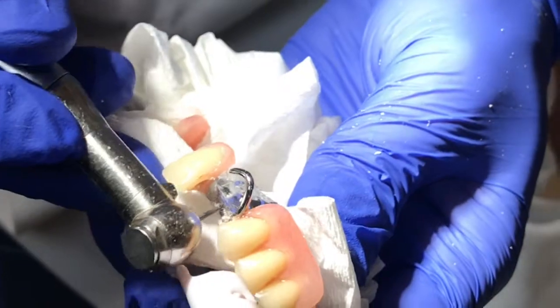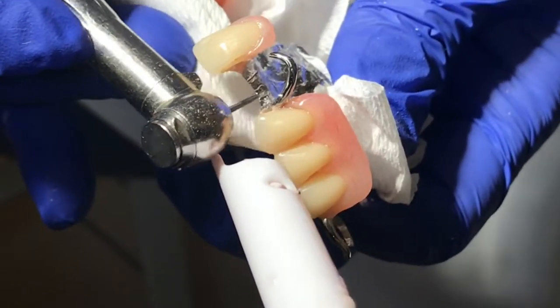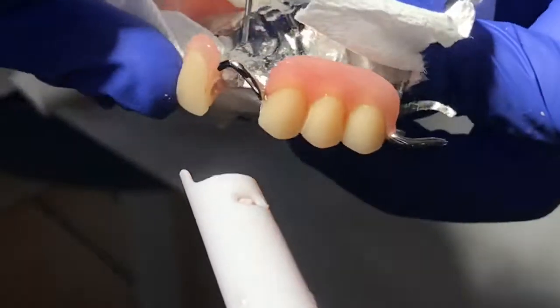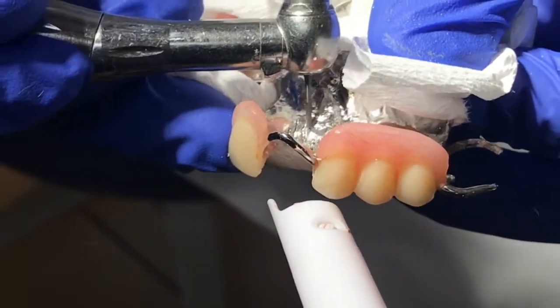Now, after you have created the mesial and distal retention grooves, you are now working on the palatal metal frame retention grooves, and roughening the surface of the metal base.